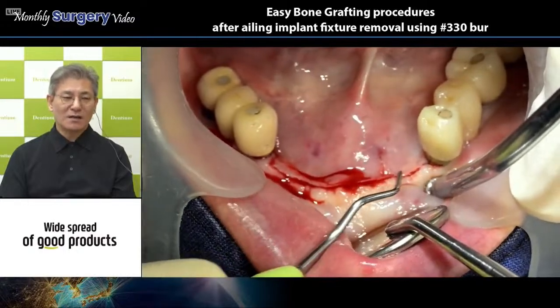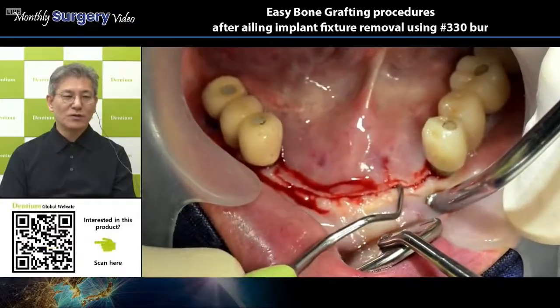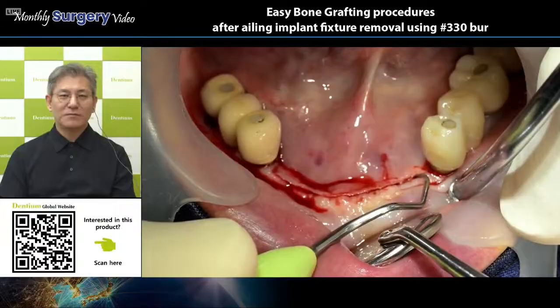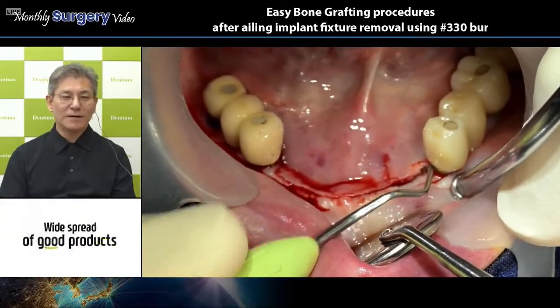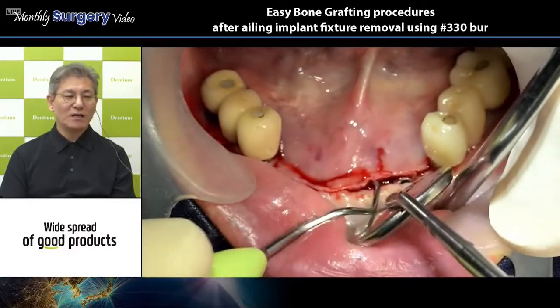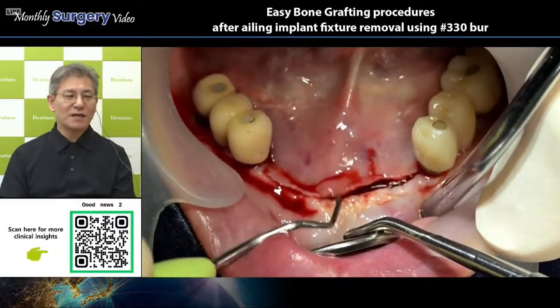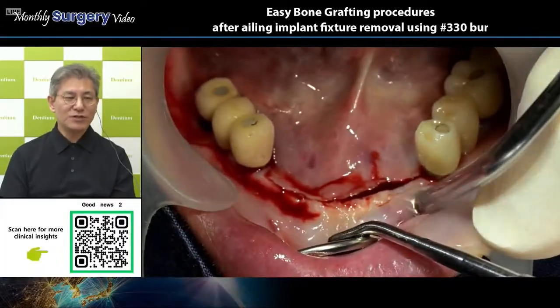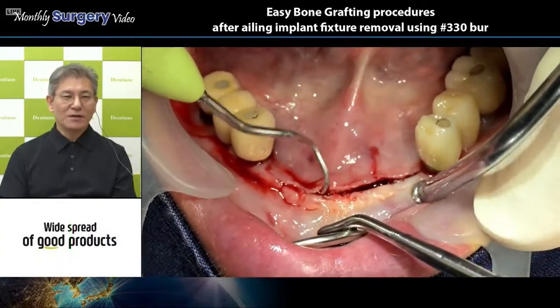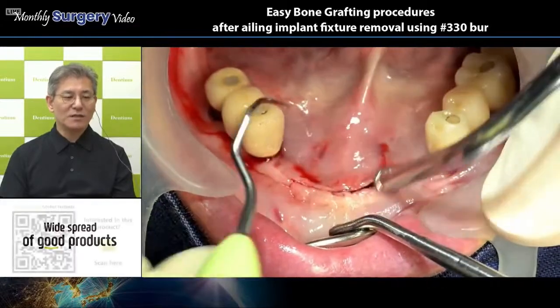Actually, this paracrestal incision is more useful to manage the reflected flap, and then to make the osteotomy, and sometimes we make the access for the crestal approach for sinus elevation. All of these situations are possible when you have the paracrestal incision on the maxilla.